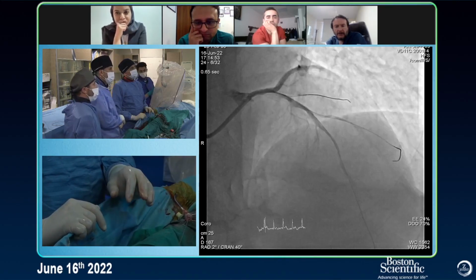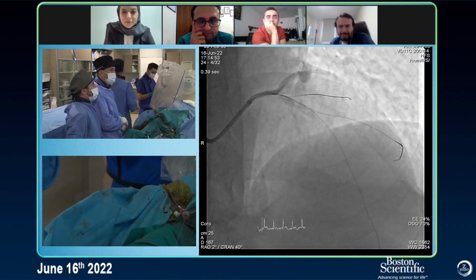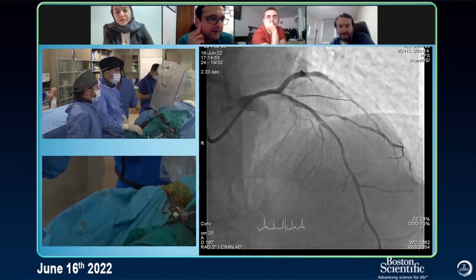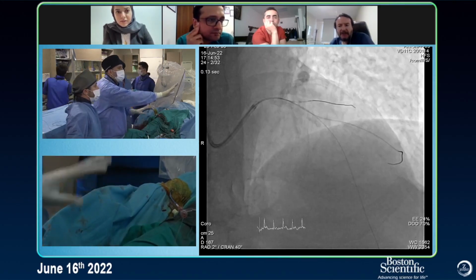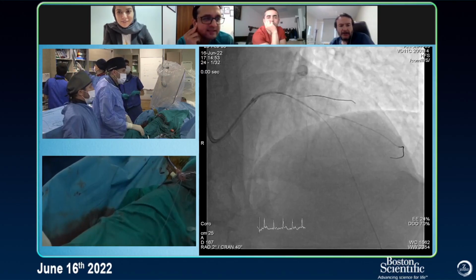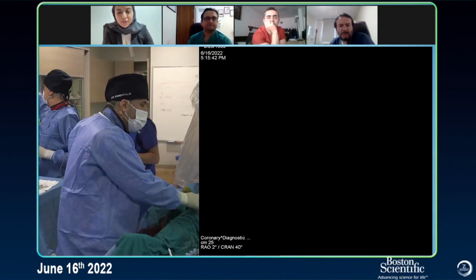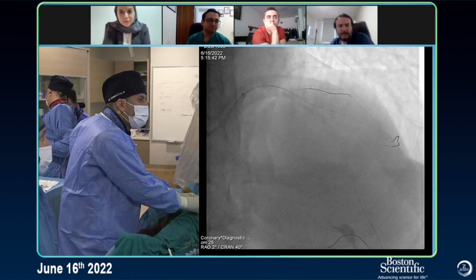crush rather than... Yes. We need to do something. Diagonal first. I am craving for seeing the IVUS now. 2.5 and 3.75 for the LAD. Diagonal, what are you going to do? 3.75. You can do a nano crush for that diagonal, with a balloon in the LAD.